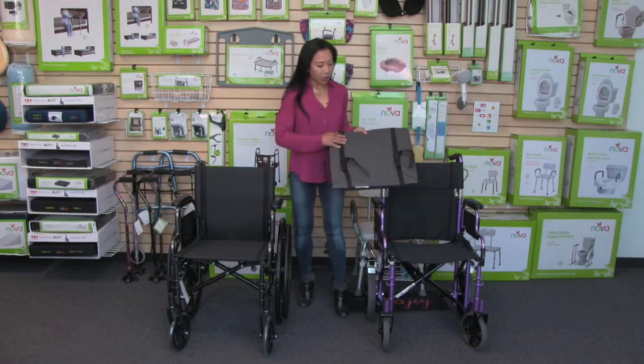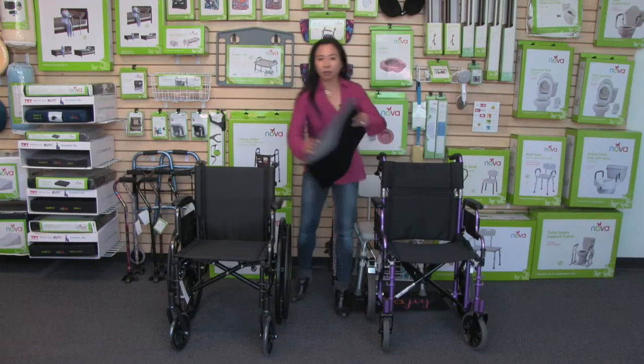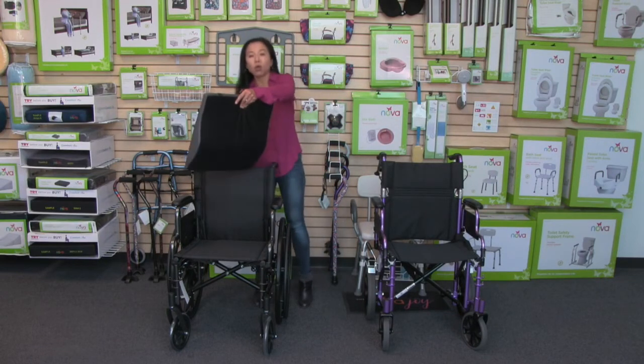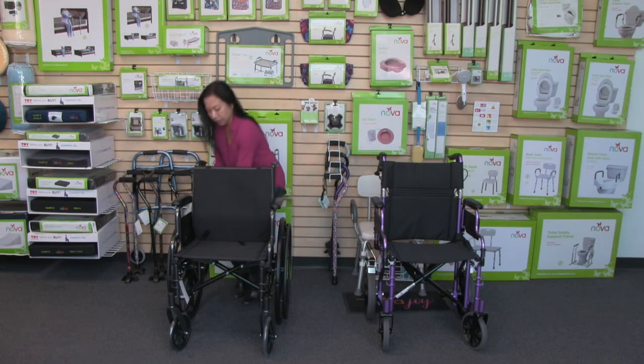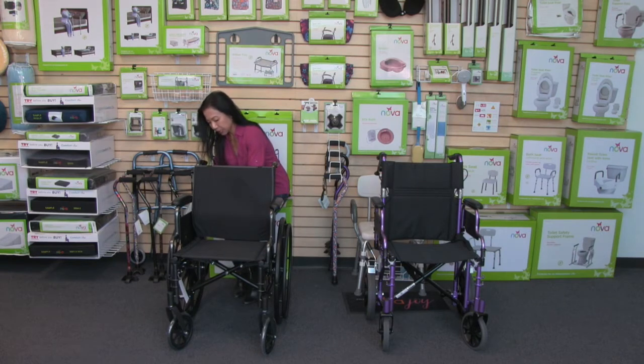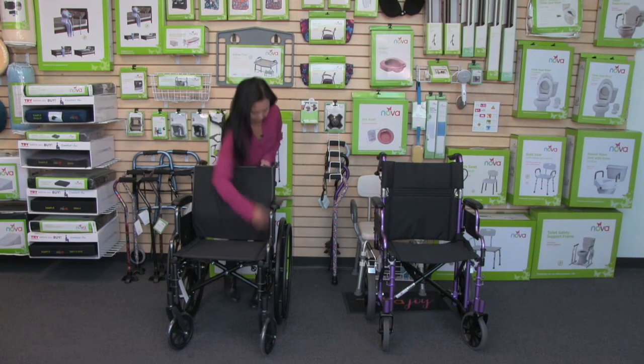This lumbar cushion comes with dual straps on the back, and that makes attaching it to a wheelchair really easy and keeps it nice and secure. It's really easy to take the straps and just clasp them into place — same with the other side.